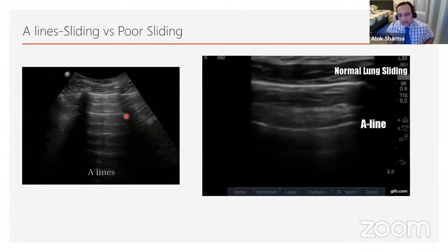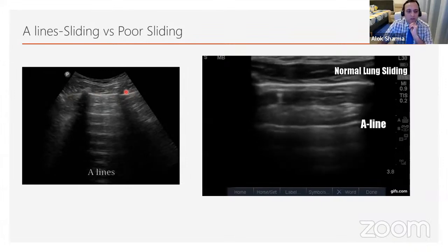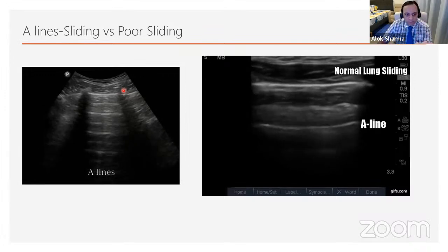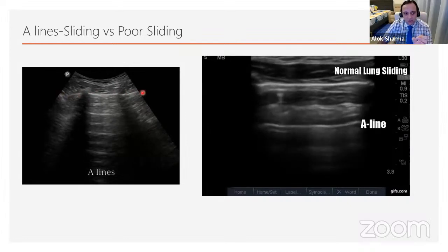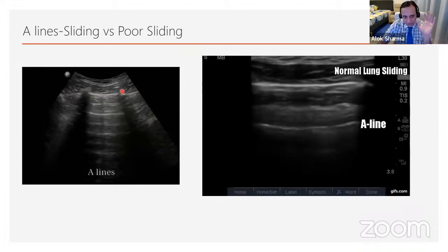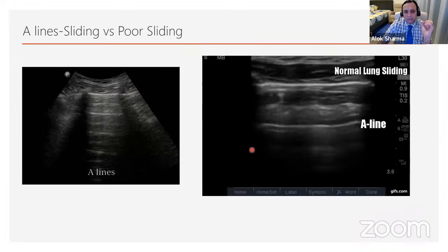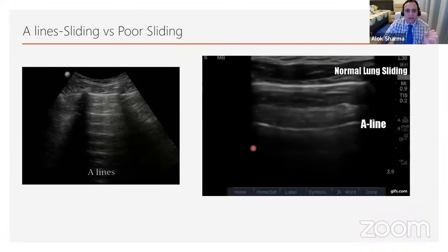But standardized terminology, when you're describing the lung in your clinical approach: first is the pleura, what it looks like. It's regular. It's linear. It's continuous. And there is sliding in all four regions. These are five things that you must always describe about the pleura. And then you are moving to your A and B line pattern. That would be standardized description as per international lung guidance.